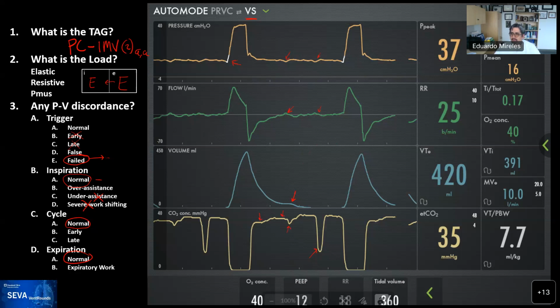So I see a couple. In a patient with failed trigger, they're saying decrease the sensitivity. I see that sensitivity, and then there's one about decrease the target. So here you have to define what etiology you think is causing the failed trigger. And this is important for us to review a little bit: what are the potential causes for a failed trigger.